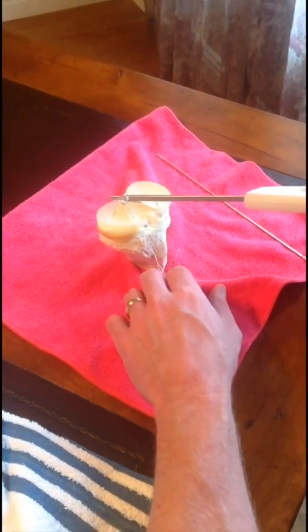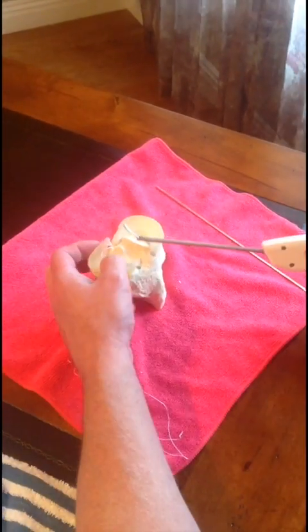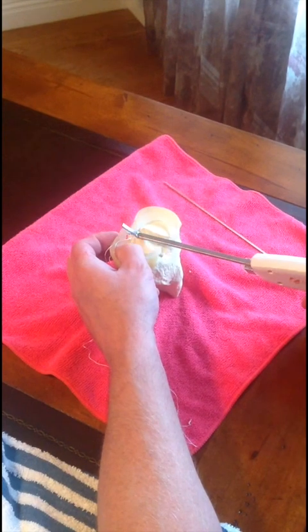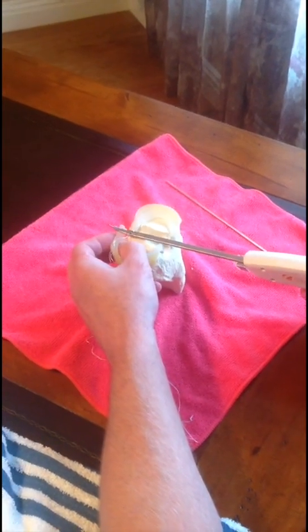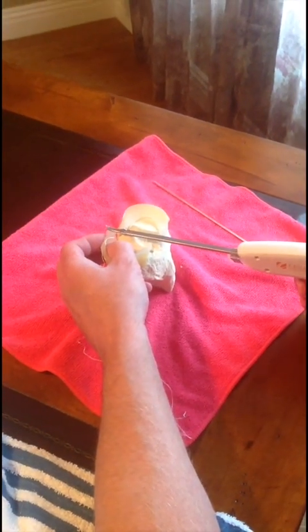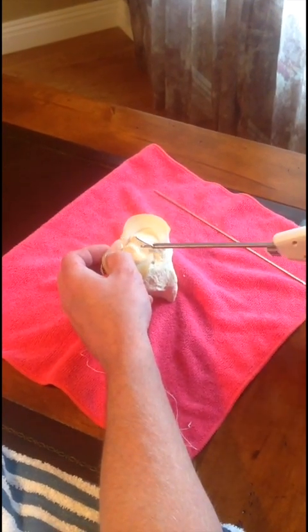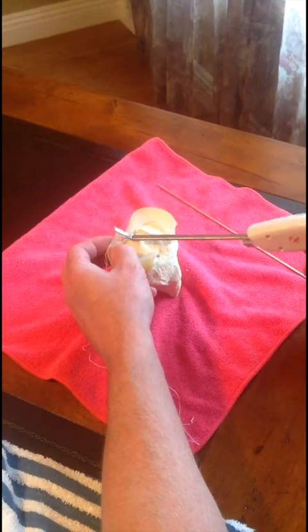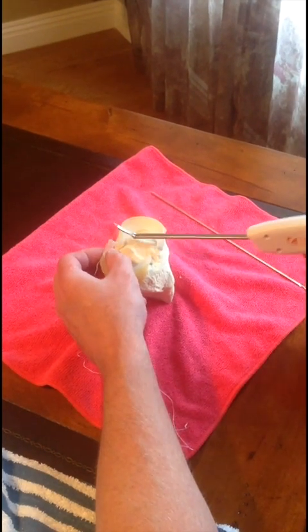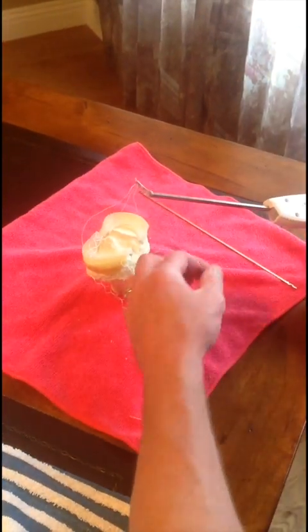Sometimes I'll pass more medial to lateral or lateral to medial — it's just a matter of which is the easiest to get to so I can pass my second suture. I'll go ahead and pass a second luggage tag; in this case I put one more anterior, so now I'm going to put one more posterior because I want to get good compression down onto my root repair. Once I pass through, I'm going to pull out of the same portal I've come in, retrieve that bottom loop, and pull the suture tails out of the top jaw through my bottom loop to create an all-inside luggage tag, which makes it much easier for suture shuttling.